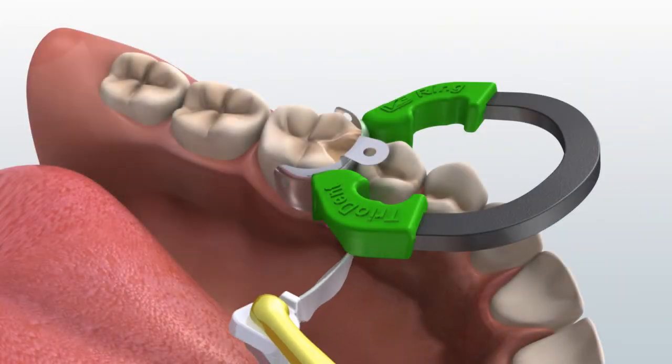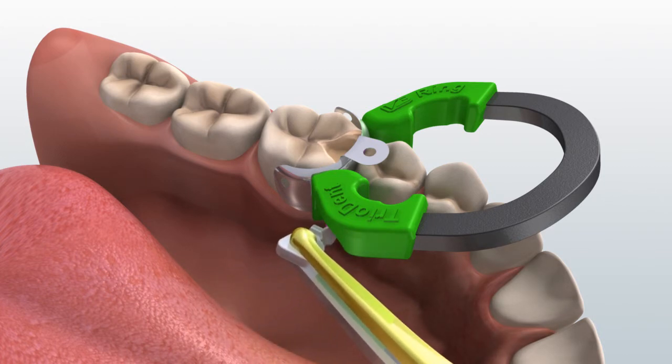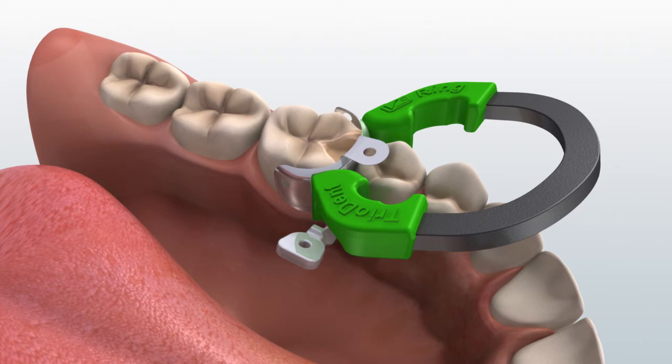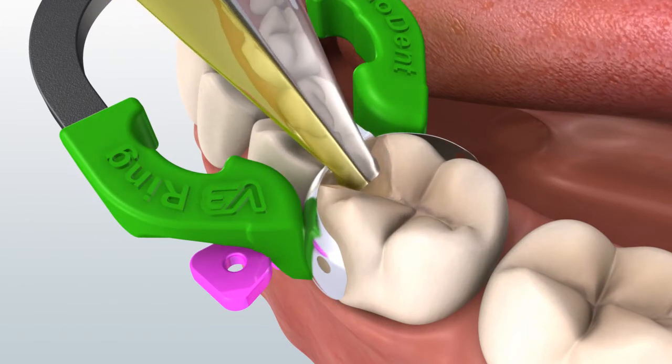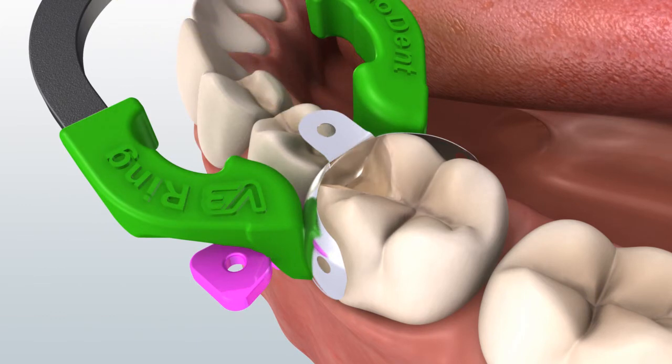If necessary, you can place a second wedge from the other side without having to start over, thanks to the hollow underside of the Triodent wedges, which makes them easily stackable. Use a burnisher to ensure that the matrix is in contact with the adjacent tooth, and there is no gap at the gingival margin. Etch and bond as usual.